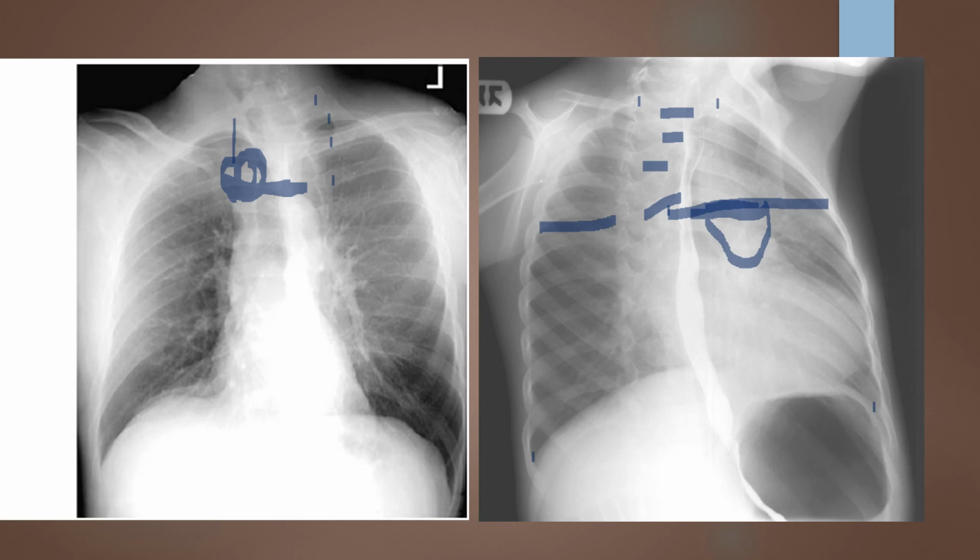So if my exposure index was at a good point, if I had window and level capabilities, and if we have 10 ribs, which I think 1, 2, 3, 4, 5, 6, 7, 8, 9, 10. We do have 10 ribs. I know my inspiration was adequate. I don't have any superimposition of the arms or chin, so I'm going to say that this is an acceptable image.